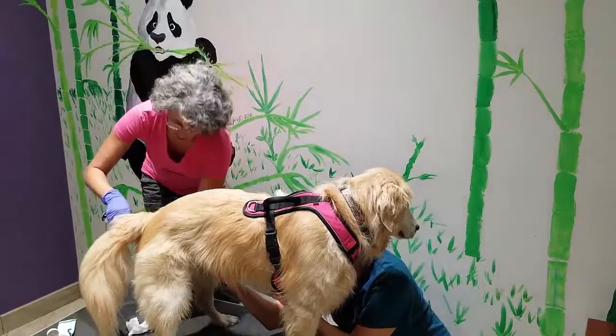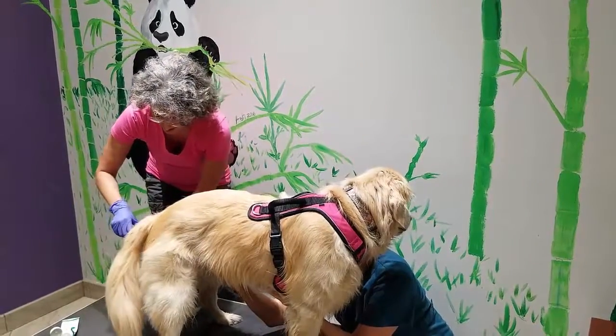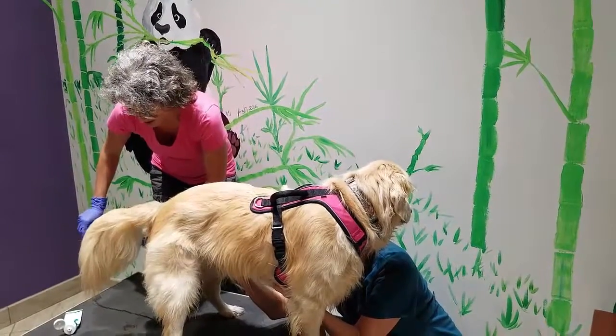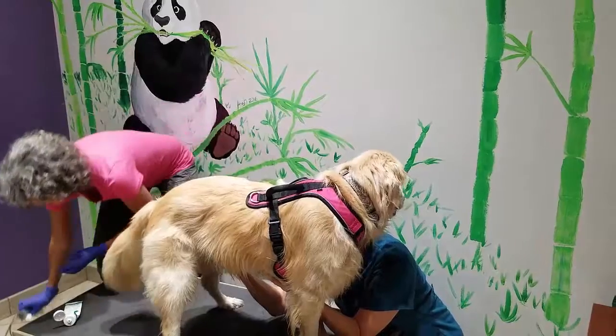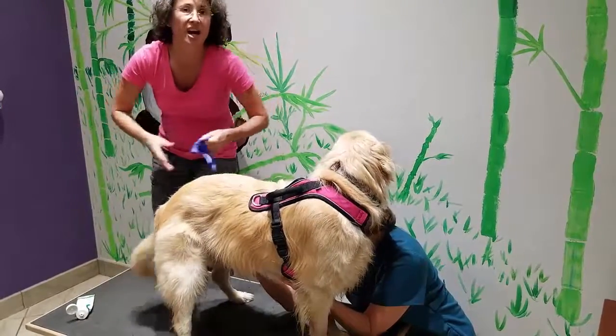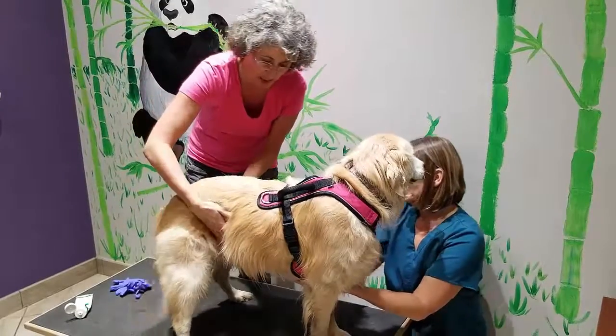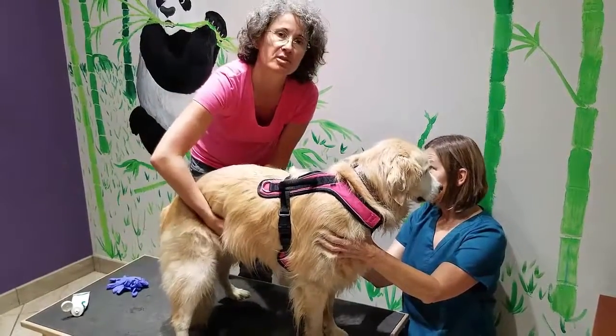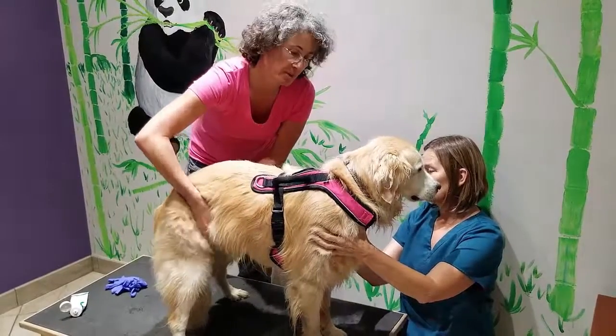As you can see, Willow does not mind it at all. And then I'm going to do just a little bit of a tummy massage, shake it around a little bit, so that it distributes in the GI tract and on different loops.